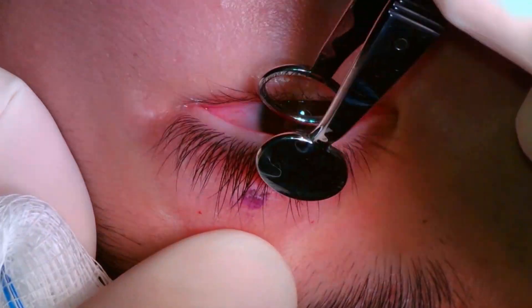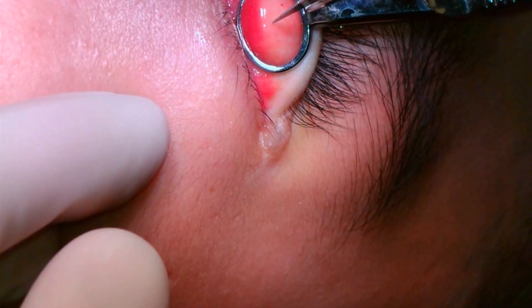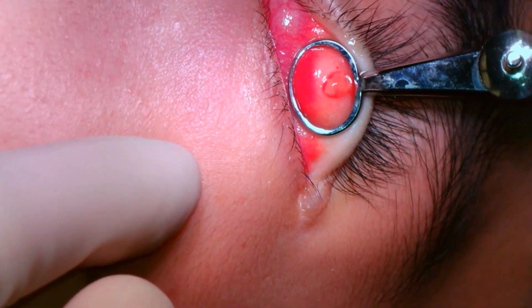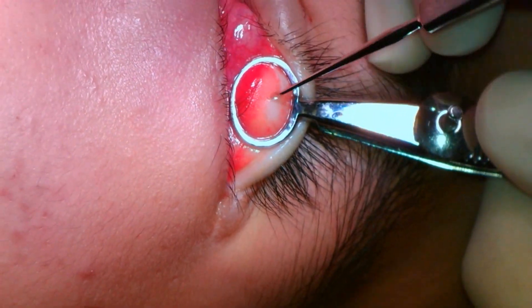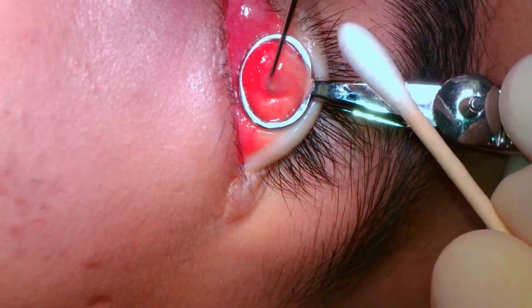An antibiotic ointment will be placed over the wound and in the eye, and an eye pad will be placed. The second chalazion is located on the upper eyelid. I always mark the area on the skin so that when I inject local anesthesia, I do not lose the area of the chalazion. The chalazion clamp is placed, and an 11 blade is used to make an incision through the conjunctiva and tarsus overlying the lesion. The contents are then expressed with cotton tip applicators, and the curette is used to remove the remaining material.